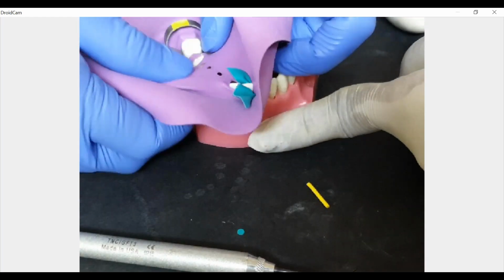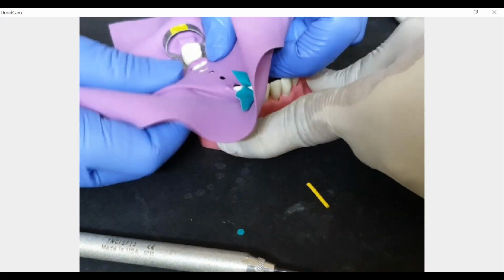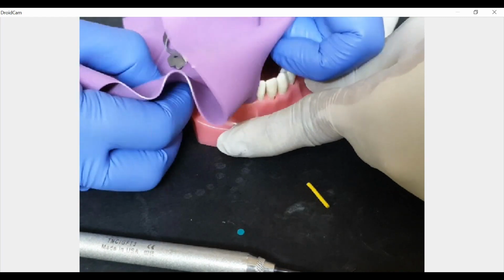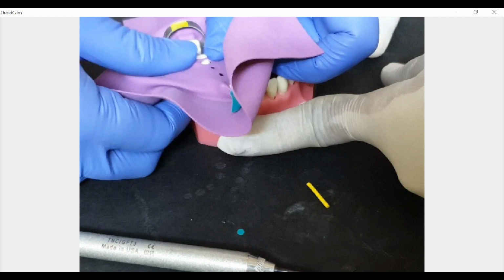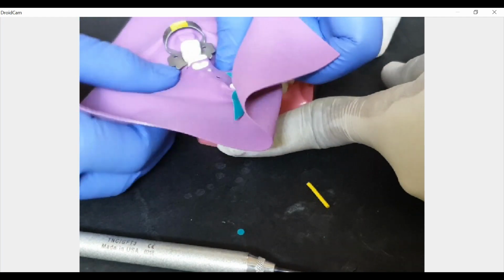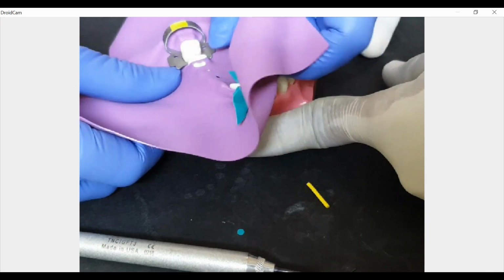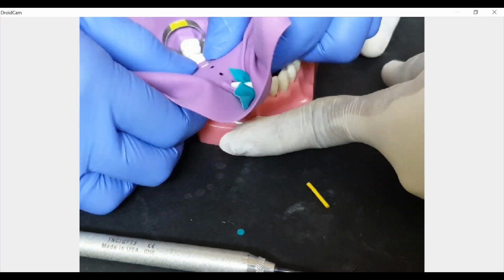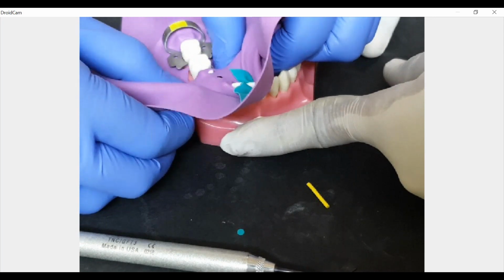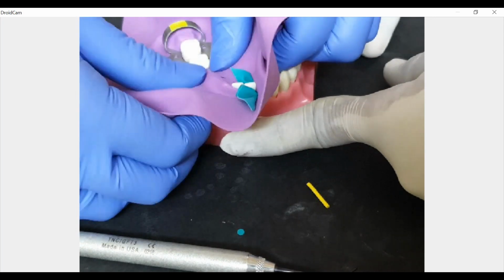So then we move on to the next one. See, again, I'm using knife edge technique here. Never get confused with the number of holes in your multi-teeth isolation. Stay calm and take it one at a time. So then comes the next one. The next one, again, knife edge technique. And then the next one.